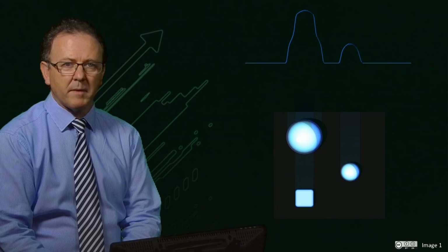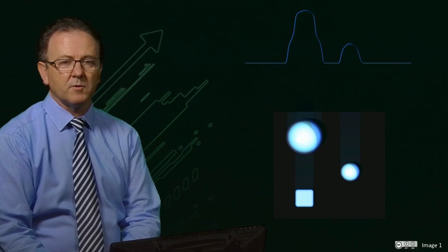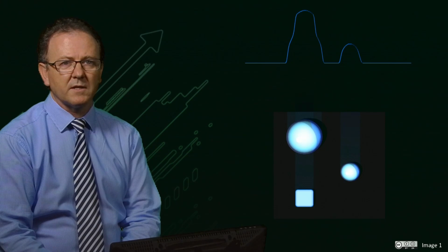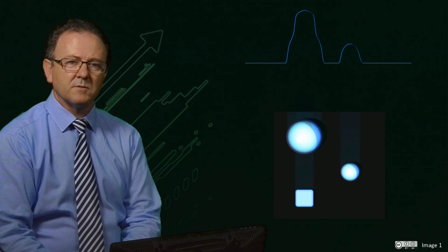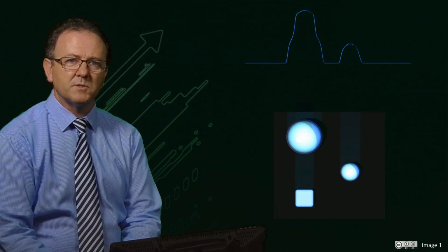This technique is known as back projection reconstruction and was one of the first proposed MR imaging methods, for which Paul Lauterbur received the Nobel Prize in 2003, together with Sir Peter Mansfield, who invented the slice selection method we described earlier. Back projection reconstruction is not used routinely in MRI systems today. Instead, the second orthogonal direction in the slice of spins is also spatially encoded with another gradient, and a Fourier transform is applied along each direction to produce a two-dimensional image.